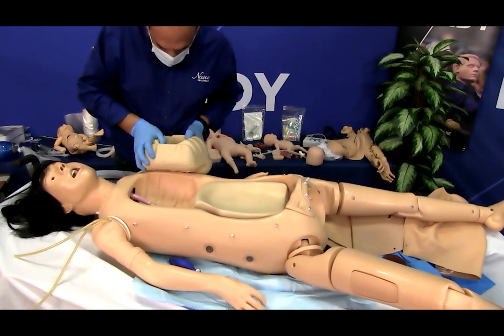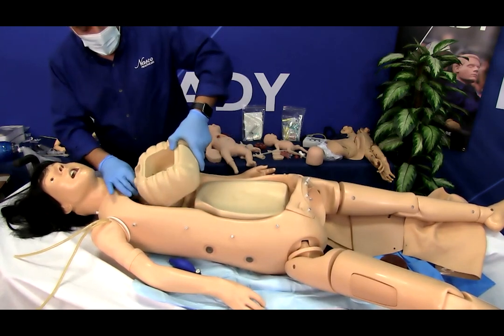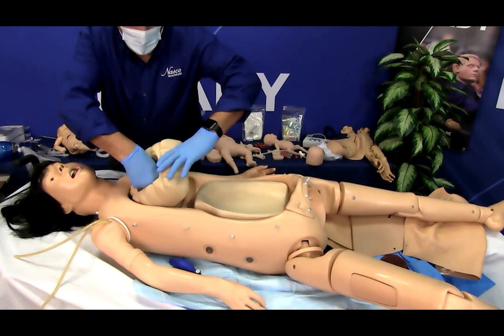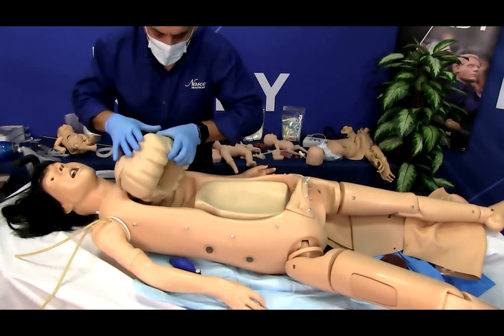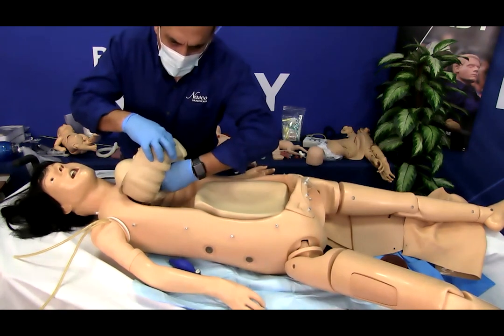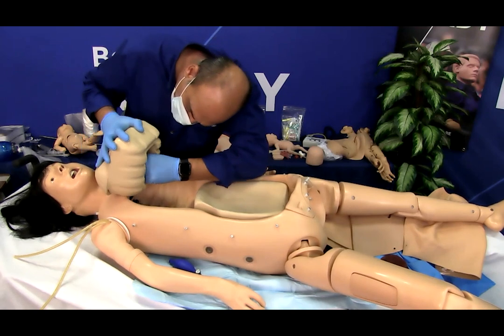Insert the trachea tube with the elbow connector into the hole at the top of the foam CPR chest. And finally, connect the trachea tube with the elbow connector to the lung bag port through the back of the foam CPR chest.